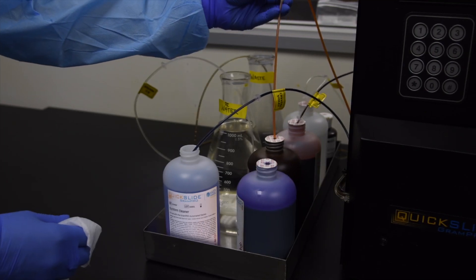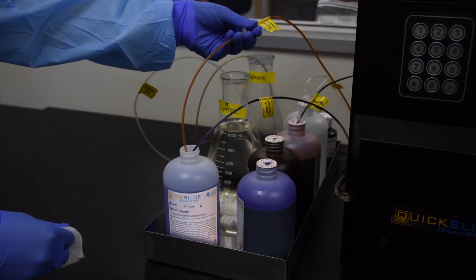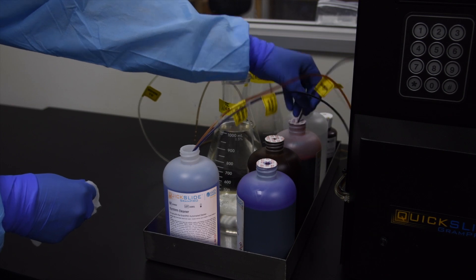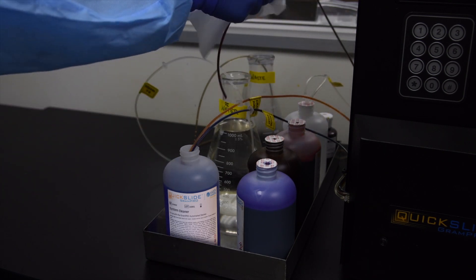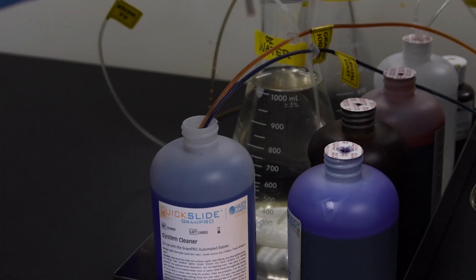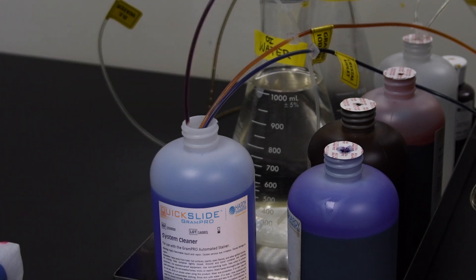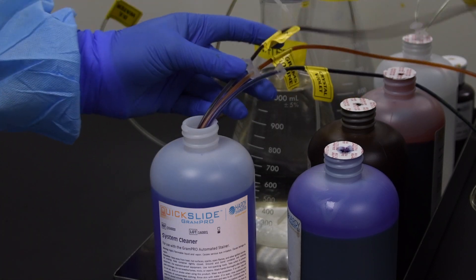When running a scrub cycle, remove the reagent lines from their stain containers and wipe off the residual reagents from the ends of the cannulas. For a scrub cycle, place all reagent cannulas into one bottle of system cleaner.